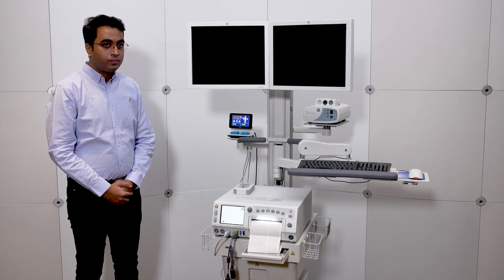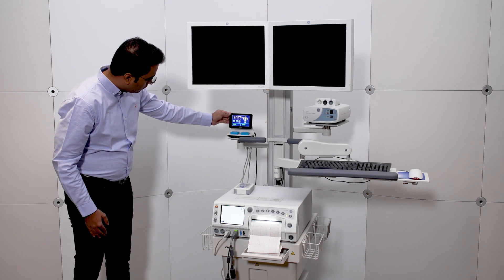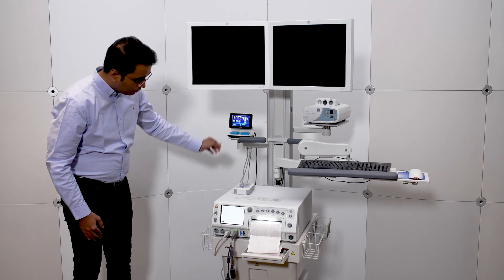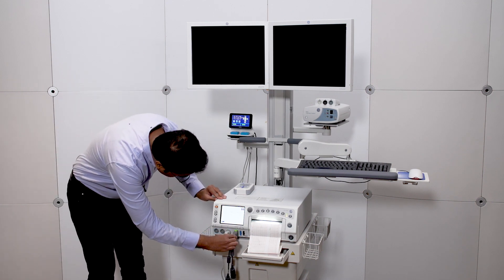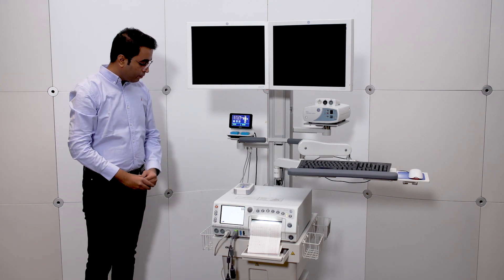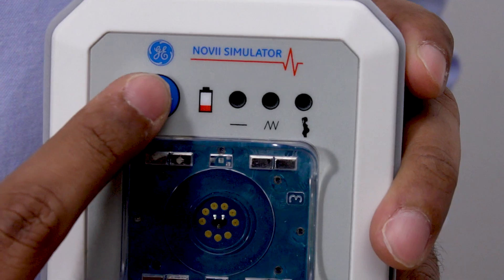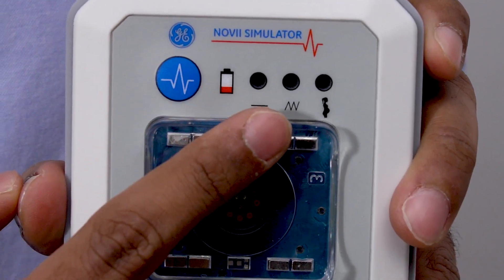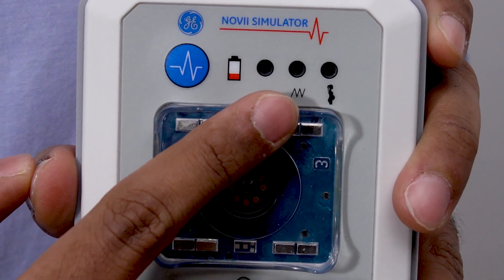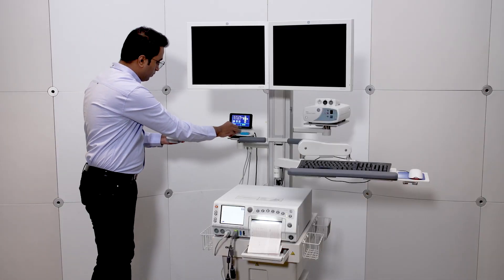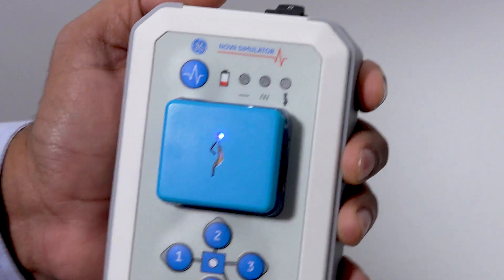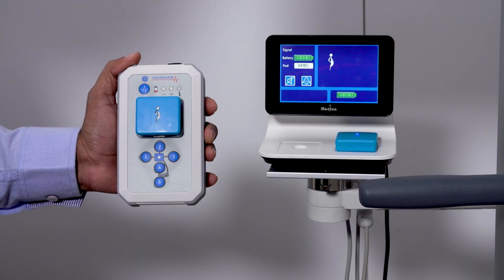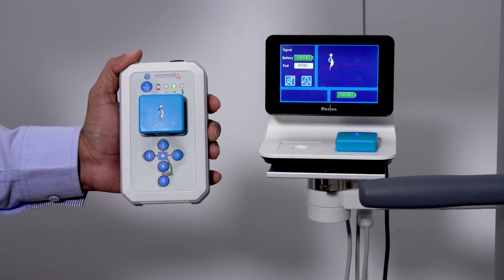Let's try a simulation. First, make sure your Novi interface and Corometrics are connected. Then select the variable mode indicator. Check the light indicator to confirm it has been selected. Take a charged pod from the Novi interface and place it in the simulator pod clip.